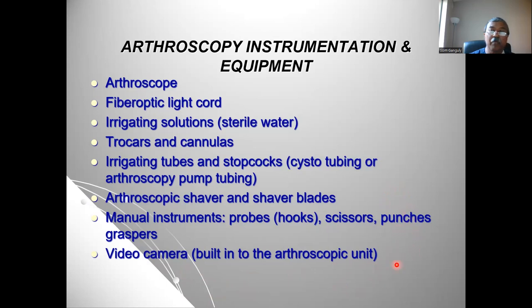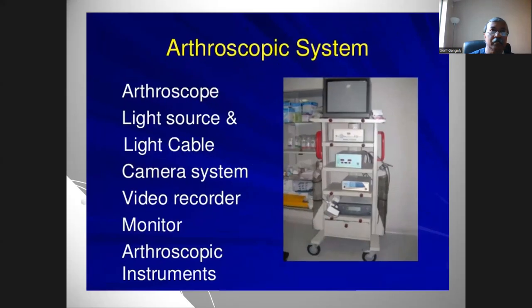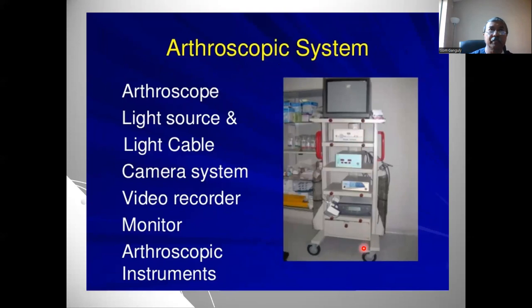Otherwise, we have video camera, and let me show you what the arthroscopic cart system looks like. We will have a cart like this, with a monitor on top, we'll have light source, arthroscopic camera, the video recorder, and here we have shaver also. So light source, camera, recorder, monitor, arthroscopic instruments like shaver. And this cart that we're talking about is required for arthroscopic surgery.